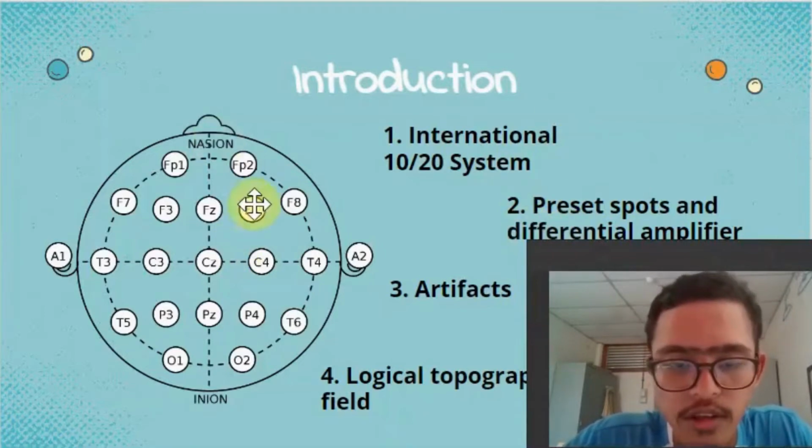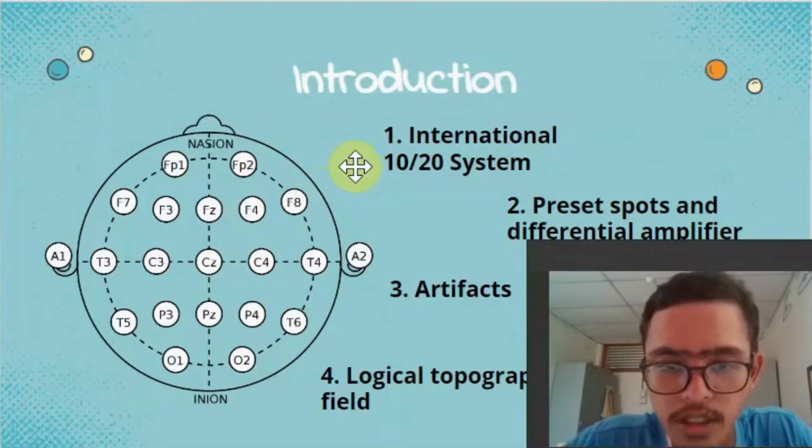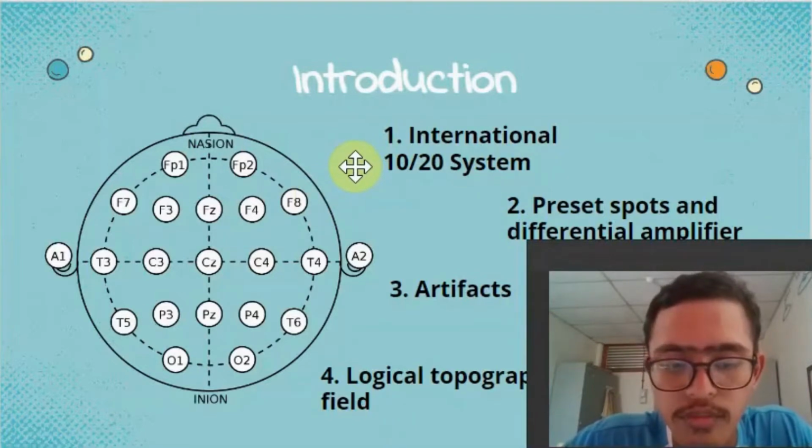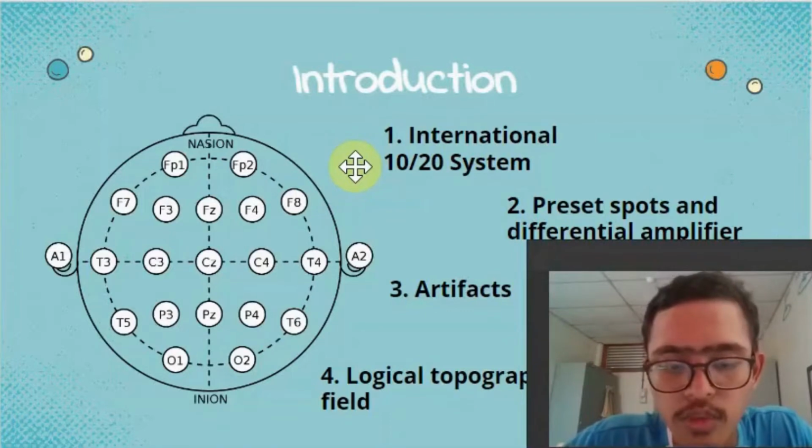Each channel traces an activity on the EEG machine. This is produced by the differential amplifier in the machine. There are two inputs on each amplifier, and each input is wired with an electrode. The differential amplifier measures the difference in voltage between these two signals at each of these inputs. The resultant data is amplified and shown as an EEG activity channel.